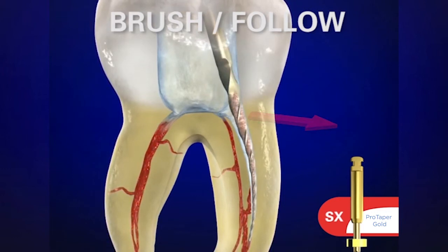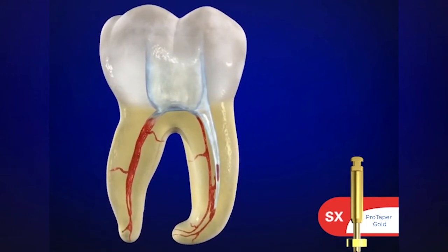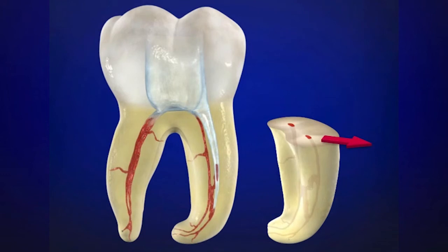Notice how the instrument is loading up. The colleague can look at the instrument and see where the debris is to know exactly where they're cutting. Very quickly, in just a matter of a few seconds, we can have a really good shape already going in the body of the canal. This is a chance to relocate orifices that are closer to the furcal concavity. Because of the awkward entry angle of the MB/ML system into the pulp chamber, they are originally a little closer to the furcal concavity. The brushing motion is done to deliberately move the canal away from furcal danger to the outer wall, resulting in more centered preparations between the mesial and distal dimensions of the root — meaning stronger endodontically treated roots post-treatment.